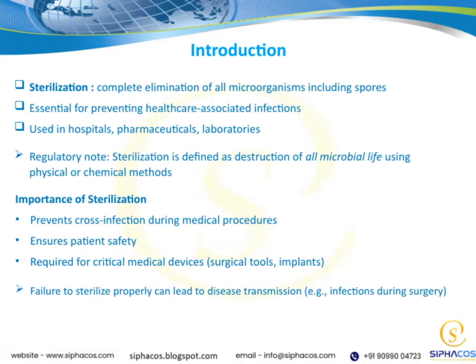Let's talk about the importance of sterilization. First, it plays a crucial role in preventing cross-infection during medical procedures. By ensuring that all instruments are properly sterilized, we reduce the risk of transmitting harmful microorganisms from one patient to another. This is essential for patient safety, as it helps protect individuals from potential infections.